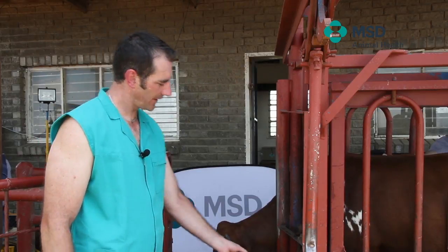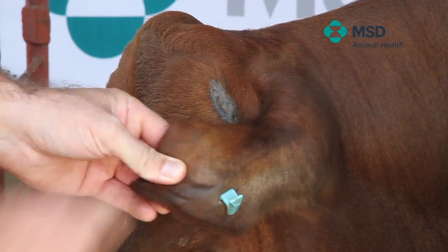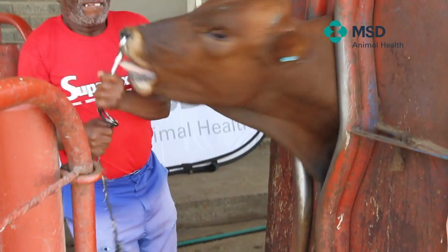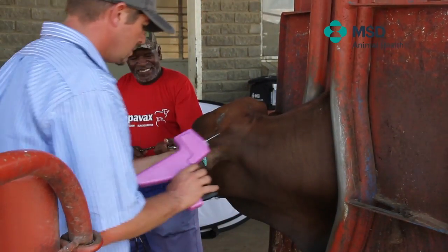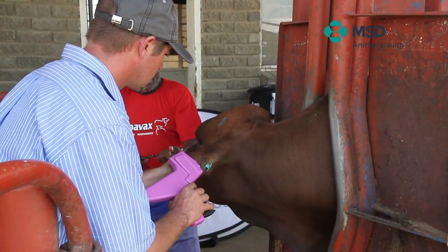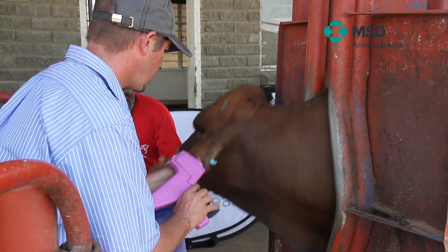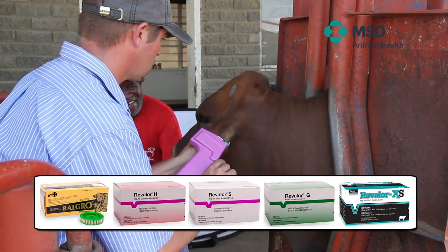The correct implanting technique and place is behind the ear, between the two cartilages, in the middle third of the ear. Insert the needle underneath the skin, taking care not to do it within the two cartilages. After removing the needle, pinch the hole for a few seconds to make sure that the hole is closed so that the implant cannot escape.